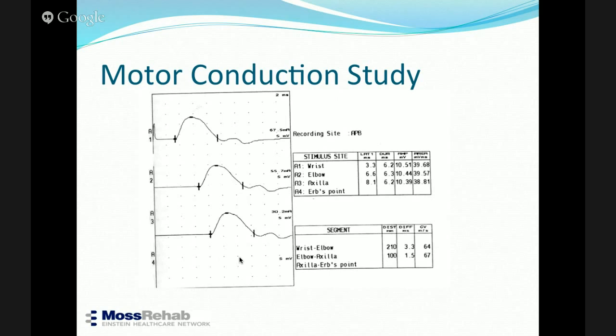That is, your negative phase and positive phase cancel out as you go proximally, and so your amplitude becomes a little bit smaller, which is actually a phenomenon which happens based on the distance. So if you go 20 centimeters proximally, if you drop one millivolt, if you go 10 centimeters more than that, it should drop only by 0.5 millivolts, if it is due to phase cancellation. But it could be pathological, like somebody was mentioning, and if it's pathological, then it would be a whole bunch more of dropout in the size.